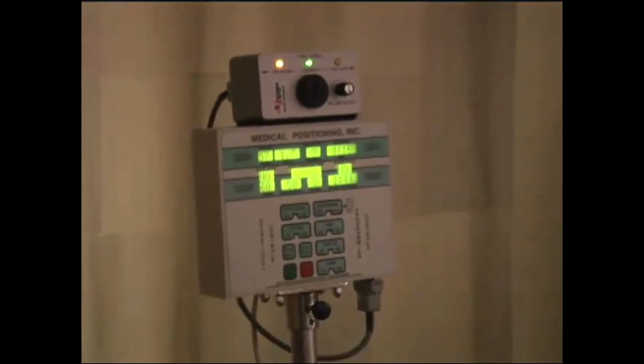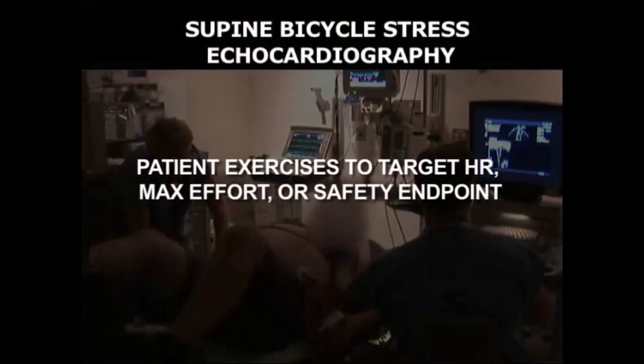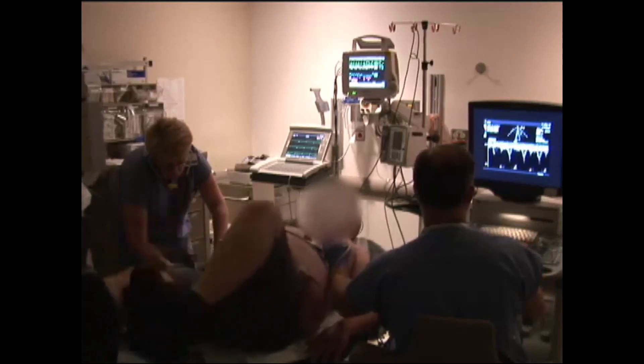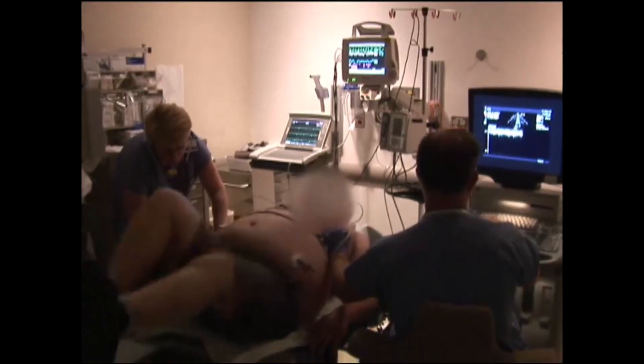The patient should be pedaling at a rate of about 60 RPMs. There is a metronome function to cue the patient to the proper speed, as well as a green light indicating that the pedaling speed is correct. Terminate the study when target heart rate is achieved, the patient has given maximal effort or is limited by symptoms, or if a safety endpoint has occurred.